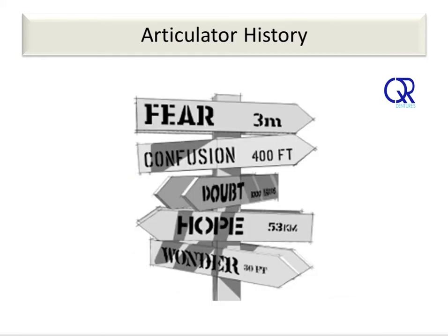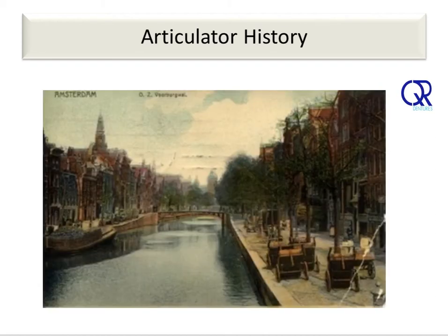It could be said that we are at a crossroads in dental occlusion. Our understanding of mandibular movement is close to the theories of the condylar or anatomic school and individual asymmetric anatomy. However, our articulators and denture teeth are based on the geometric school, which assumes anatomical symmetry. Researching the history of occlusion has revealed that there was a dentist who questioned the geometric school theories of Bonwill, von Spee, Monson and Christensen. This was Bernard Frank of Amsterdam.